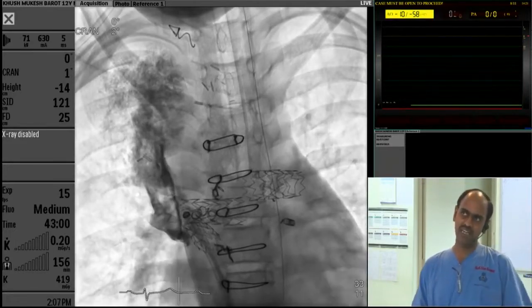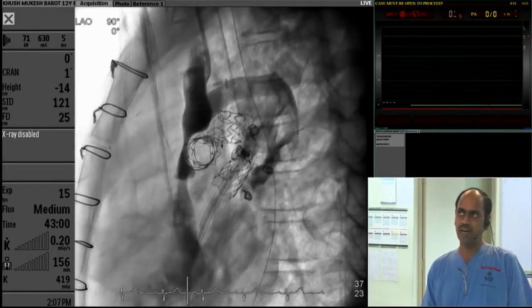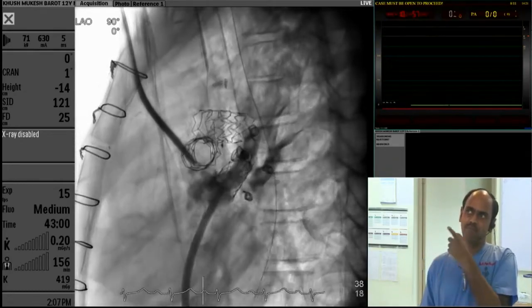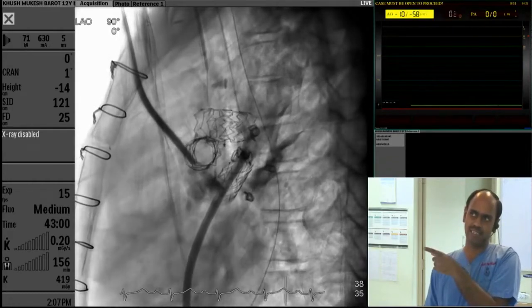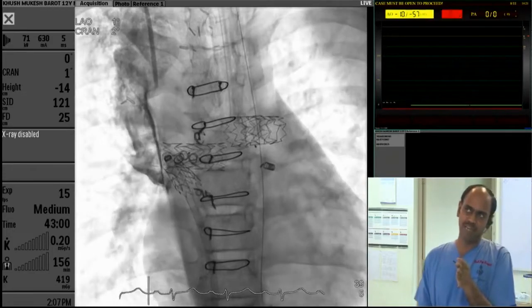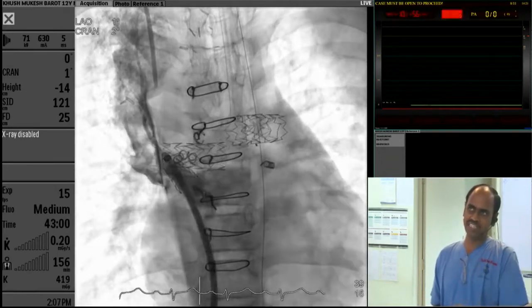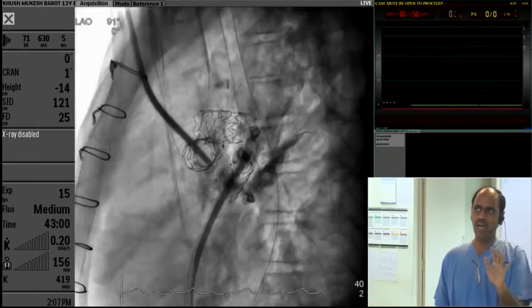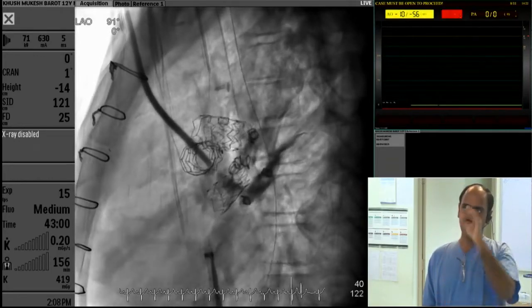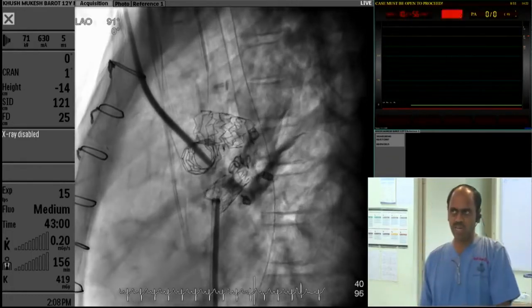This is a complete dissection into the lungs in the vicinity of the right pulmonary vein. I recognized that my pulmonary veins were still intact and patent. I pulled back from the pulmonary vein into the left atrium, then into the right atrium. The right pulmonary vein had unobstructed pulmonary blood flow through my stent. The right pulmonary vein was flowing very easily even though I had created some sort of hematoma. I slowly withdrew the sheath and recorded the pulmonary venous pressure, left atrial pressure, and right atrial pressure. Left atrial pressures were around 10 to 11.